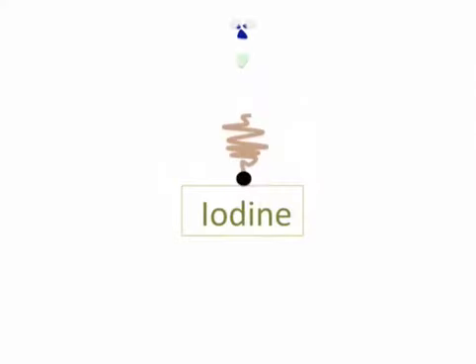So here's the normal distribution in cartoon fashion. Thyroid, obviously, if you have one still. A lot of times you're doing these whole body scans in people who are post-thyroidectomy. Salivary glands, remember, because they burn your salivary glands. And bowel, because this is how you're excreting it.